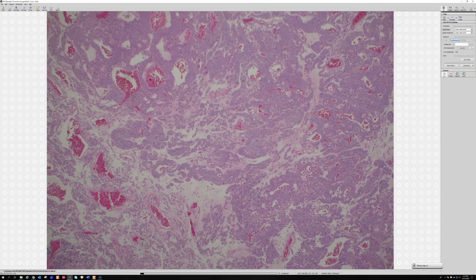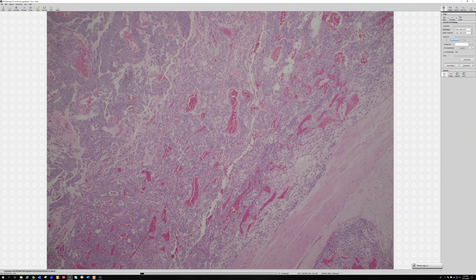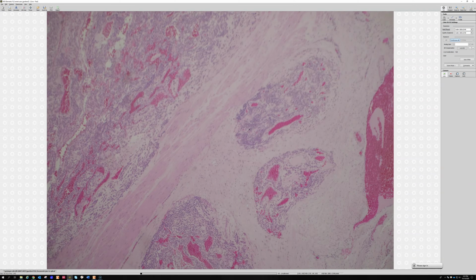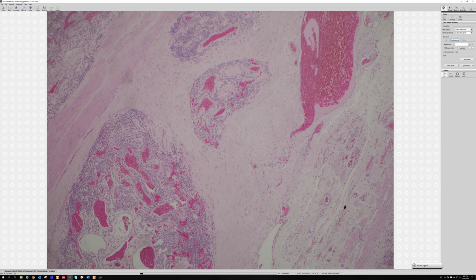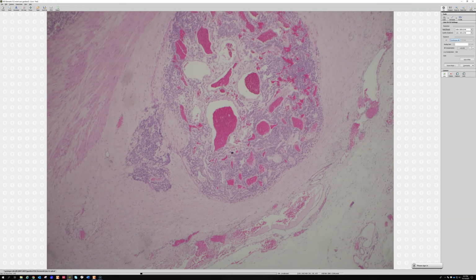Weiss taught me about glomus tumors, and what I really like is she said, when you see the nodule of a glomus, if you go out to the periphery of the glomus tumor, often you'll see this. You'll see glomus cells tracking along around additional vessels that are branched out away. They like to wrap and follow the vessels. So even if you go to the edge, you can often see the glomus cells trickling along and following other vessels around out at the side of the tumor.